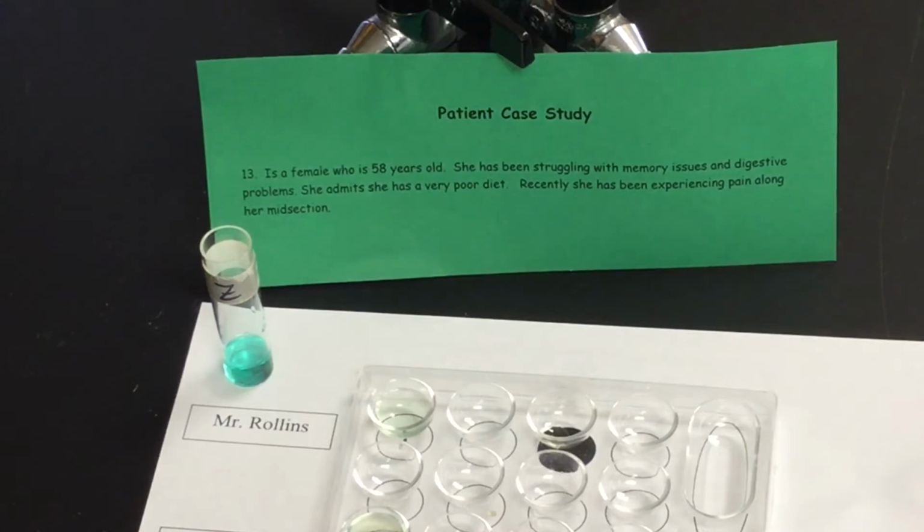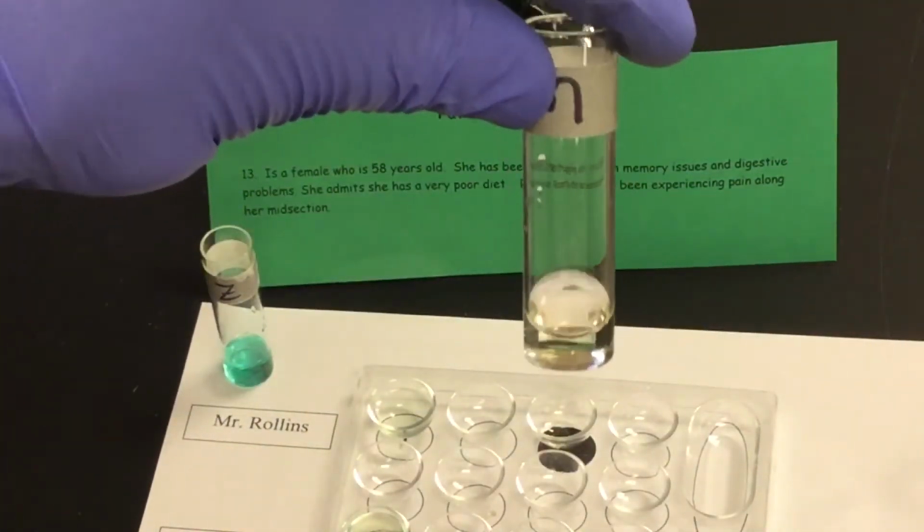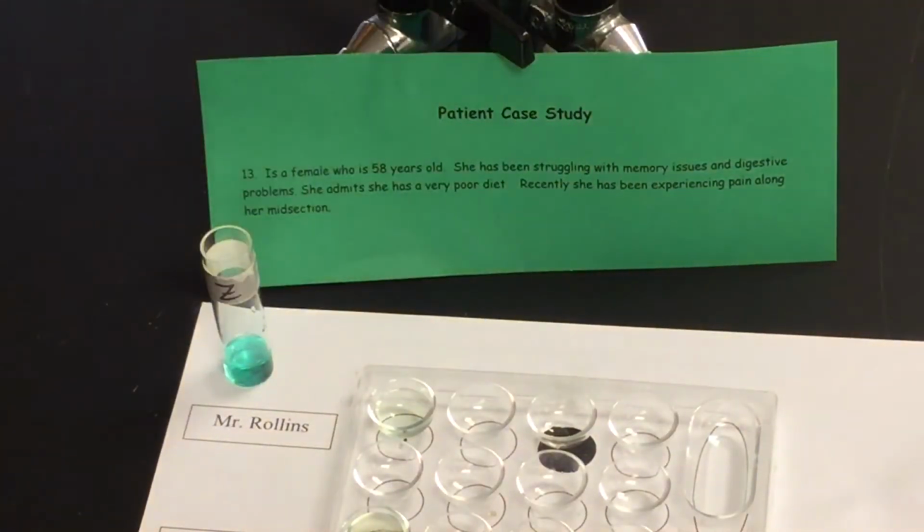As we look at the data chart, we need to go through color, clarity, as well as pH, and those are the first couple of tests that we want to do. And as we put patient number 13 into a glass tube, this is what we're looking at. I'm going to put it up against a white background so you can see our color and clarity of what's going on here.